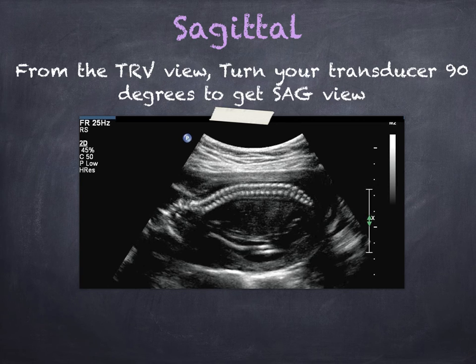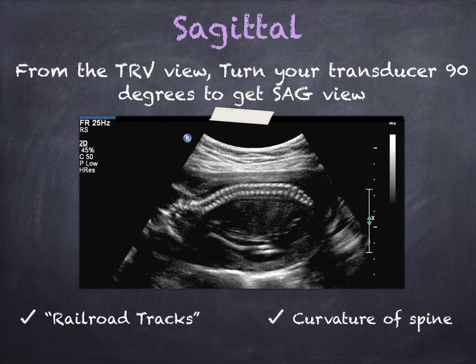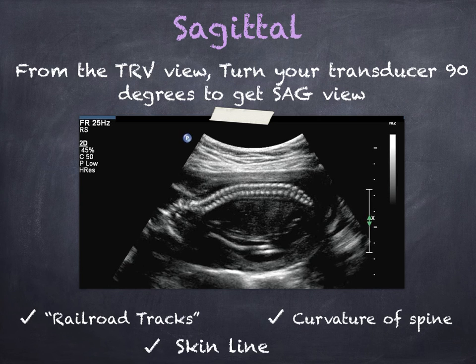Here's the image of that sagittal view you're looking for. You see the railroad tracks, the nice curvature of the spine, and an enclosed skin line.